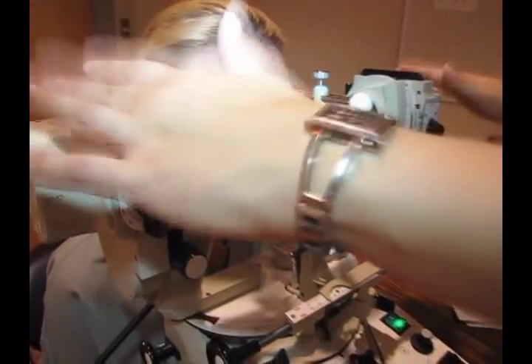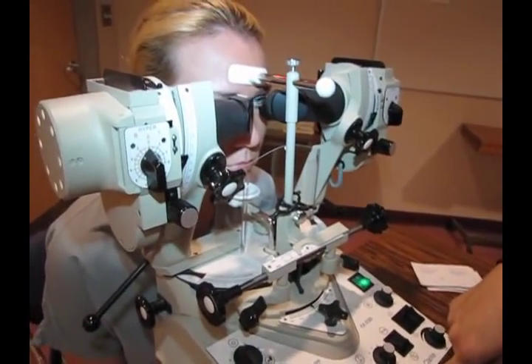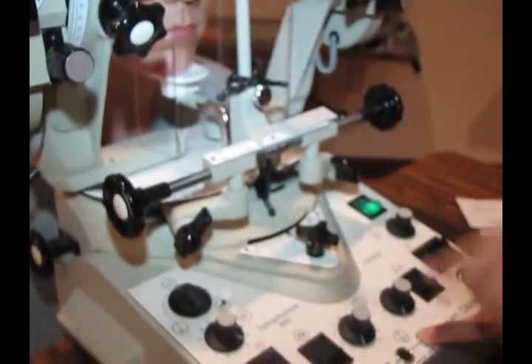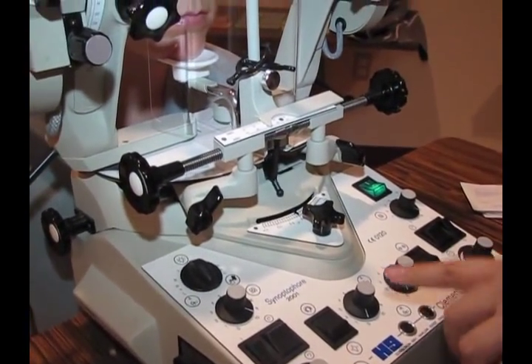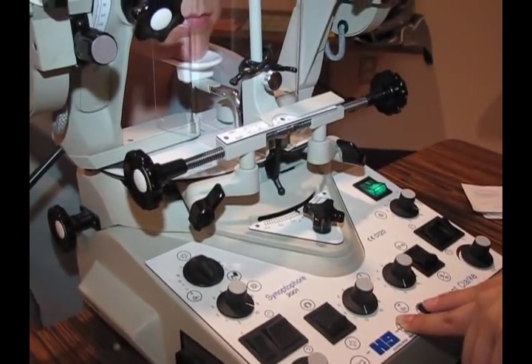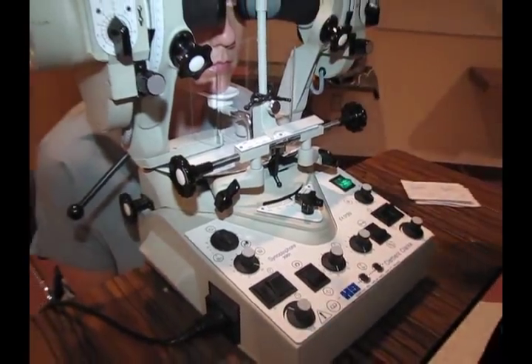So then now I ask her, tell me what you see here. So I'm covering one eye. The lion. The lion. So whenever you look at the lion, look at the middle of the lion. And now what do you see here? Cage. Whenever you see the cage, I want you to look in the middle of the cage. So now I'm going to watch her eyes above.